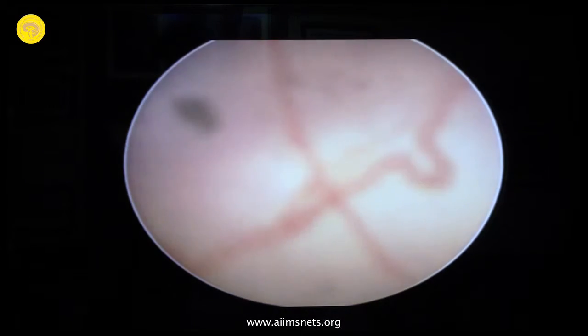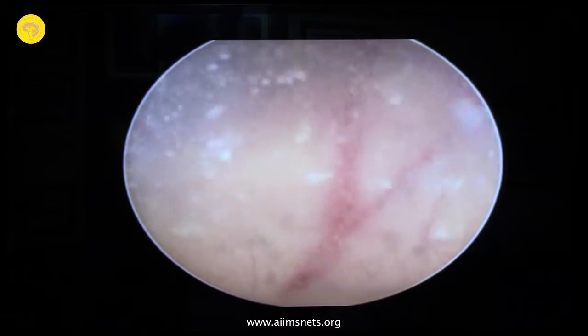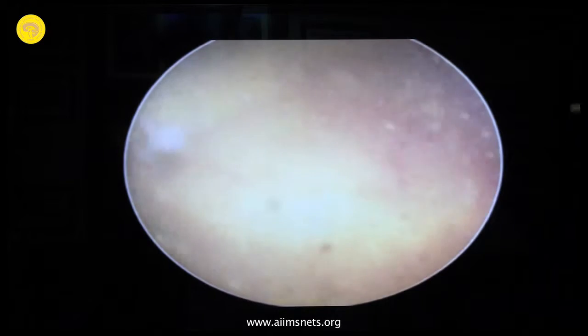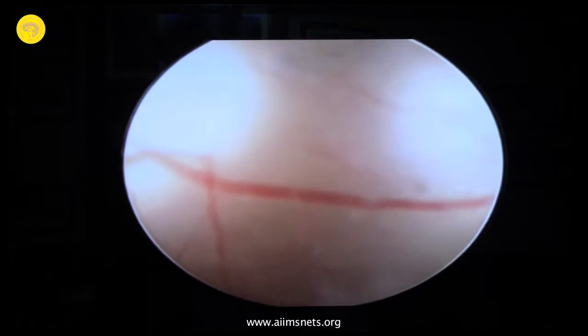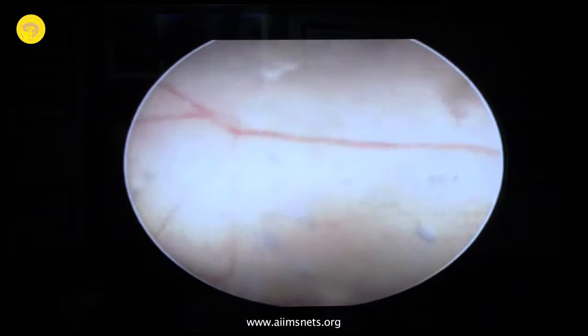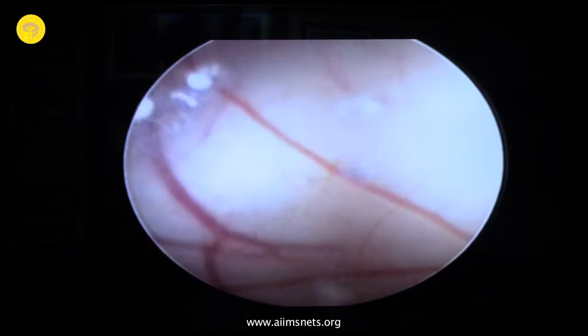Now comes your second problem. What is your second problem here? You are within the cyst here, and unless you make another fenestration from the cyst into the cisternal space, there is no way you will be able to drain it. It will close up again, it will fill up again, and it will become a cyst like that again. So what do you do?